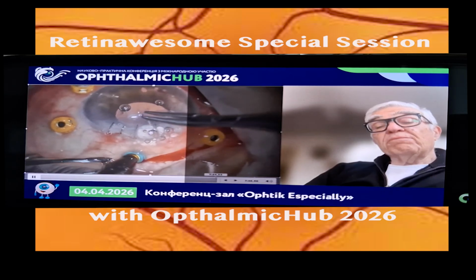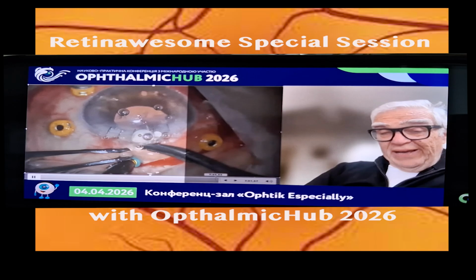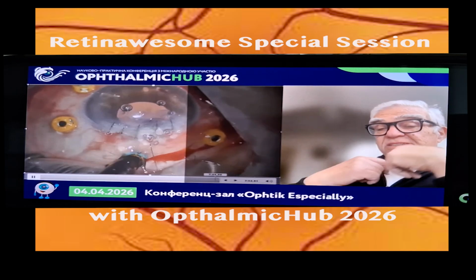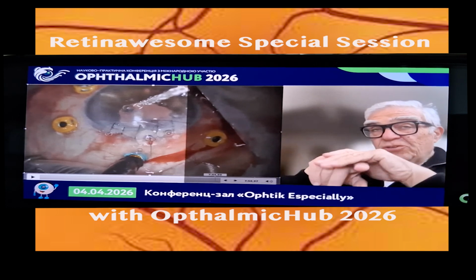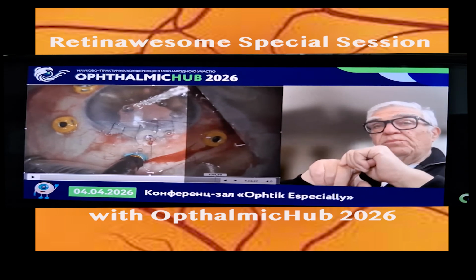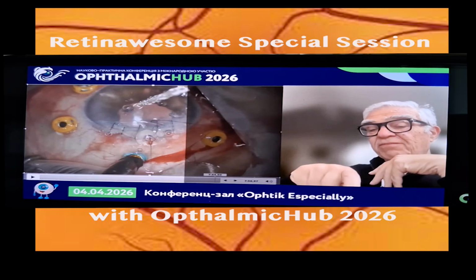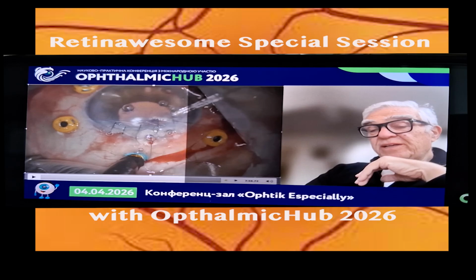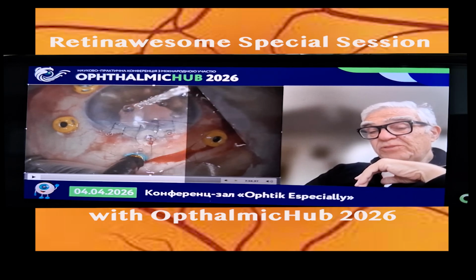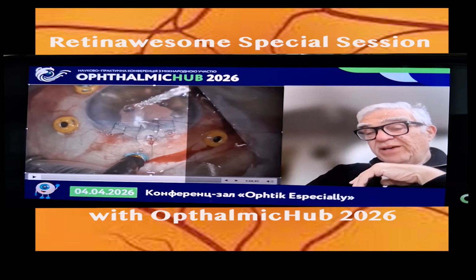And now, what happened? The Descemet has been removed, has been mobilized. And we have to suture the Descemet that we saw at the end, because of the introduction of the probe for the phaco trying to fish the nucleus. They have removed the Descemet. And it was floating. So if you leave the Descemet floating, you're going to have trouble. And the only thing you have to do is to put a suture through the cornea and the Descemet.